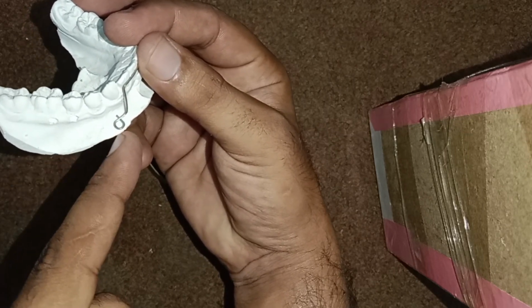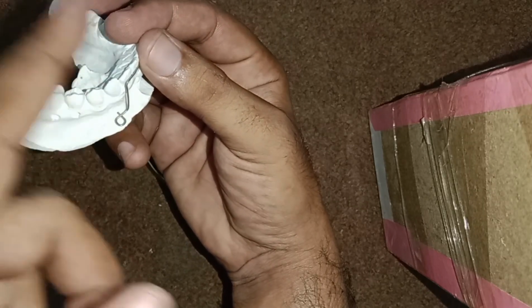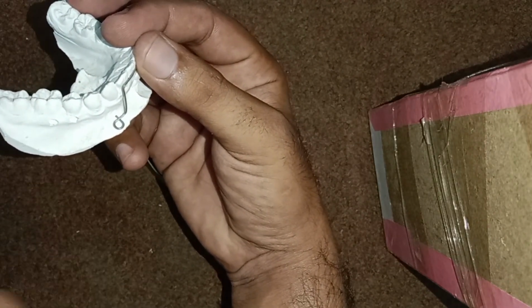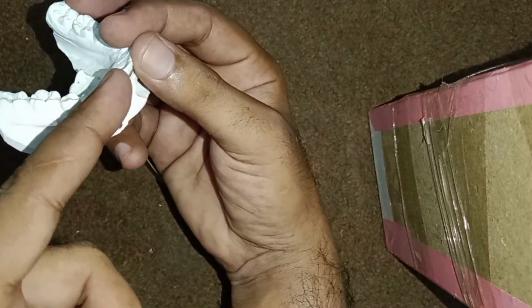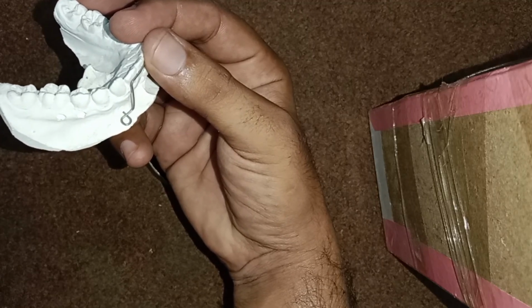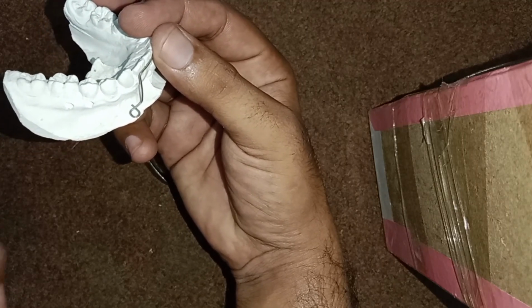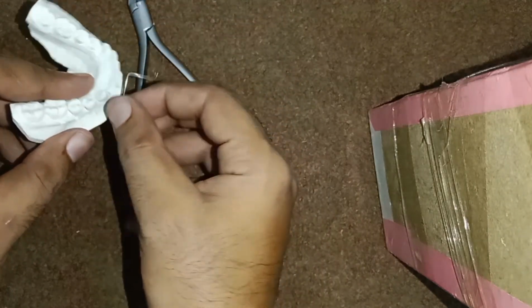Placing the power chain in this fashion will give the overall mechanics a retractive component. So we have intrusion and retraction of the anterior segment with more intrusive component and less retractive component. So this is the 3-piece intrusion arch.